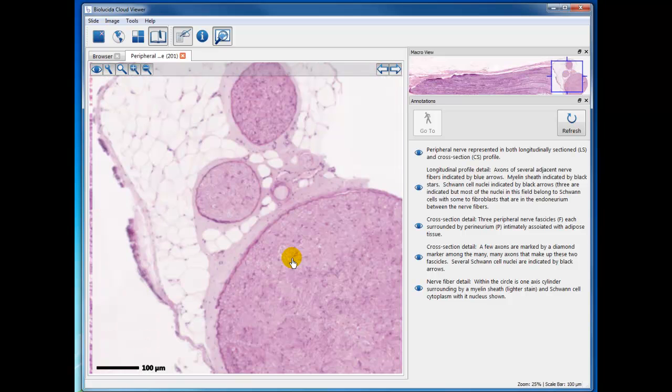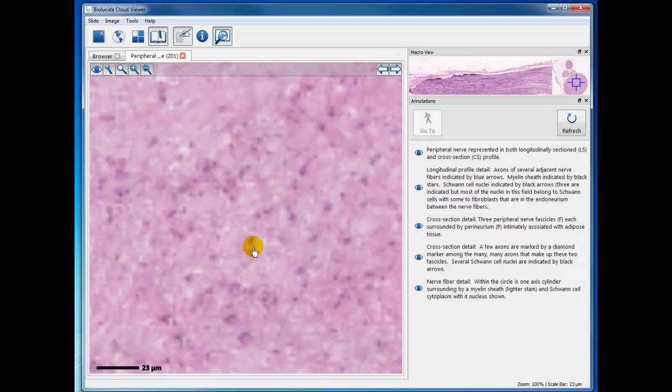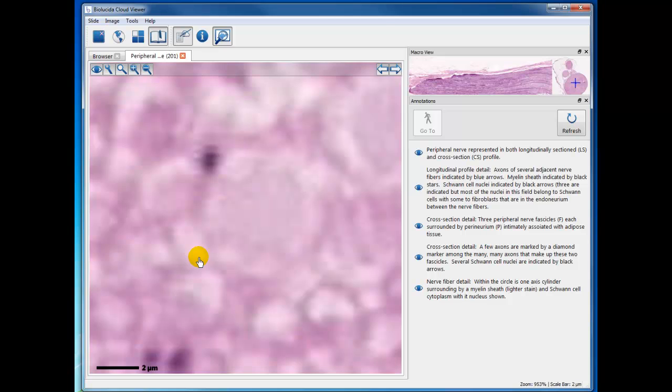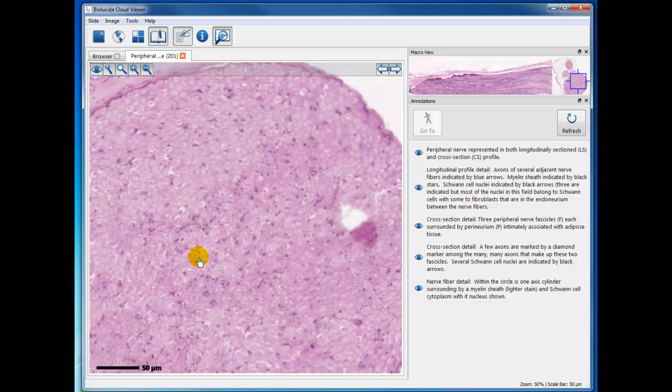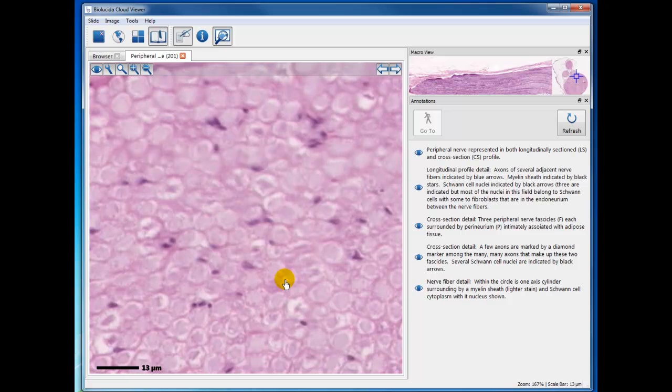And so in this specimen, it's very difficult to see the endoneurium, which would be connective tissue surrounding each one of these. You'd have to do some artificial enlargement, in which case you're just not going to be able to see that in this specimen. Up here, it may be a little bit better if we enlarge this, say this area here.